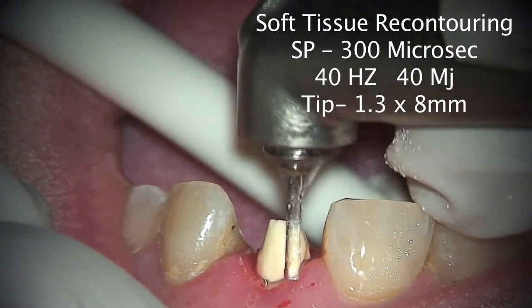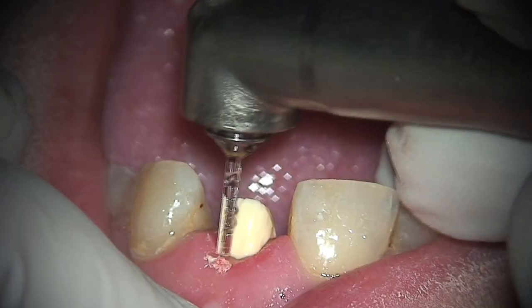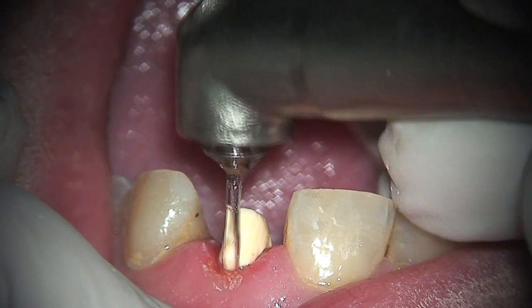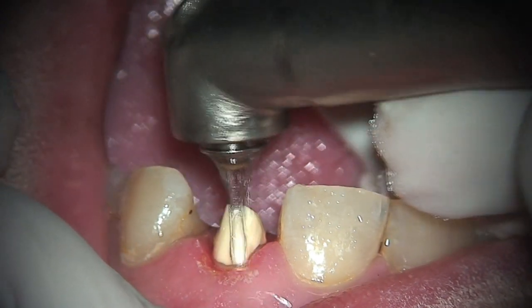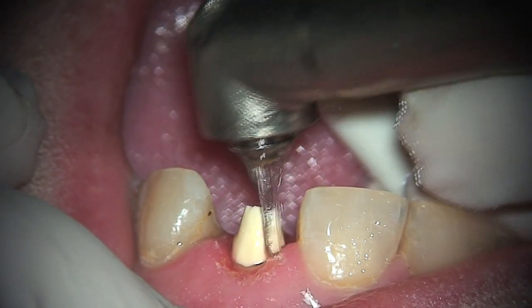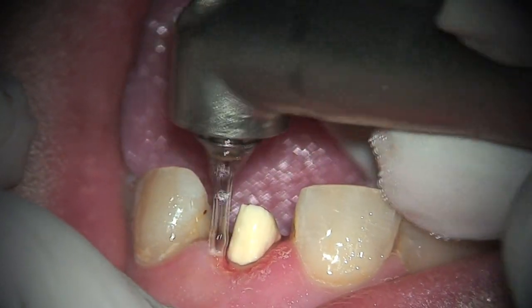One of the most important things that we have to consider is that from the build-up to the bottom of your prep must be three millimeters. That is called the ferrule — a three-millimeter ferrule.